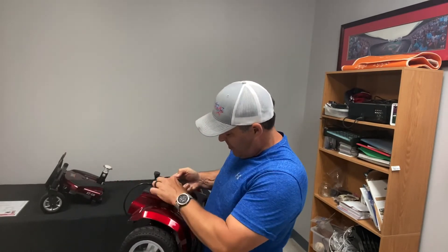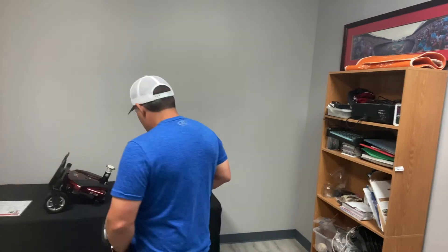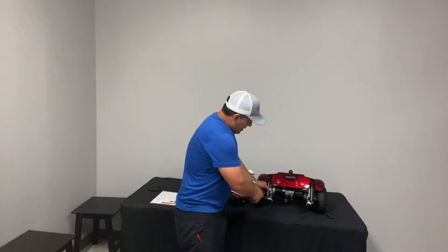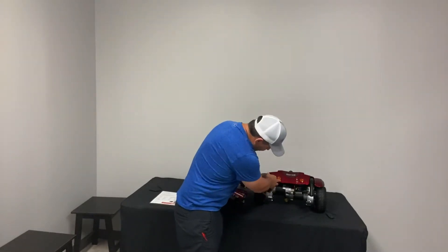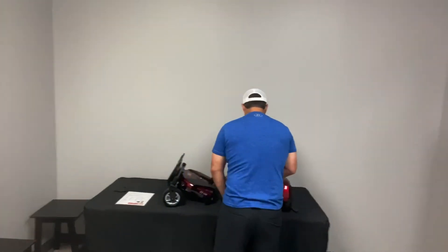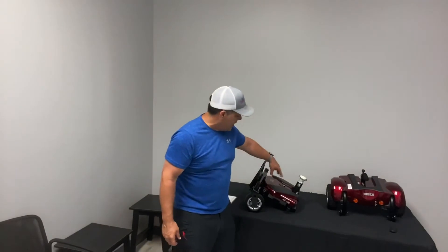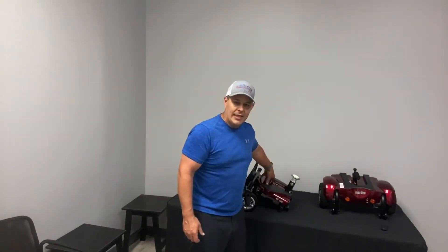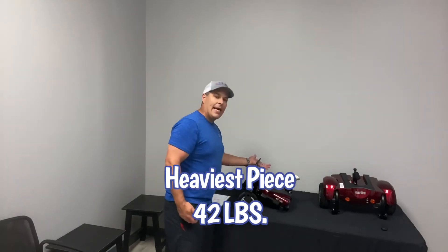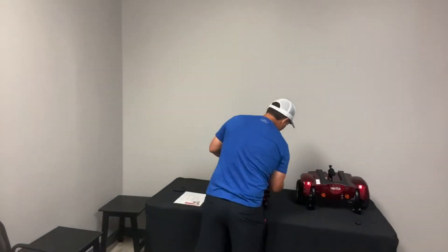There's a little red switch that will allow you to put it in neutral if the batteries do go out. The backside has your anti-tippers and some reflectors, so if you are out at night that's a nice little feature. This is your heaviest piece because the batteries are in here — the heaviest piece is 42 pounds, but it has a nice handle on the footplate and around here.